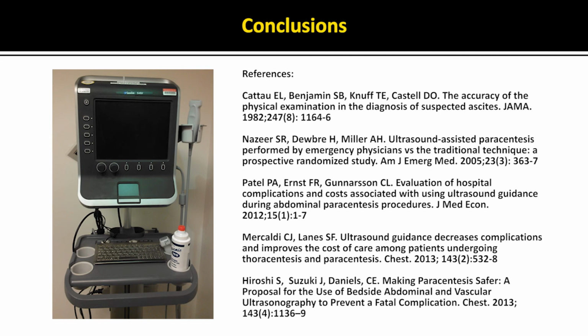The correct use of ultrasound for paracentesis, however, depends on a solid understanding of the surface and ultrasonographic anatomy involved, and sound clinical judgment about when to refer complicated cases to radiology.